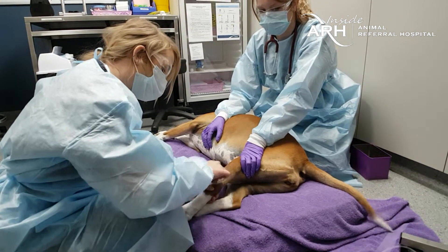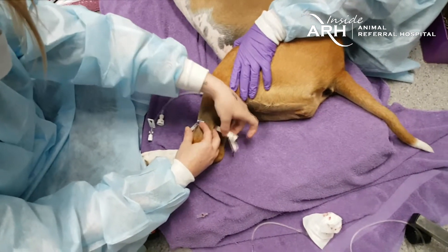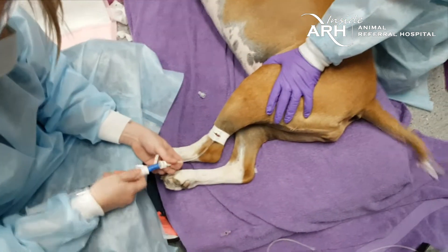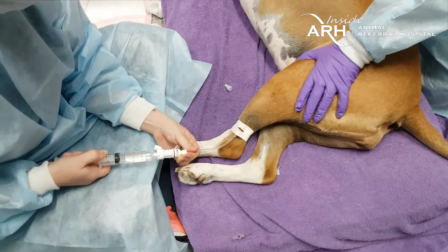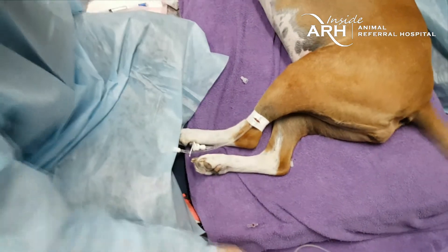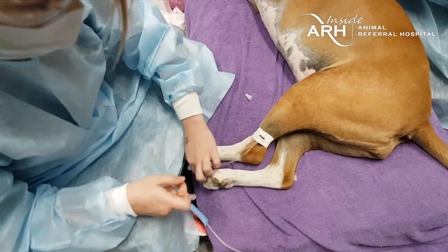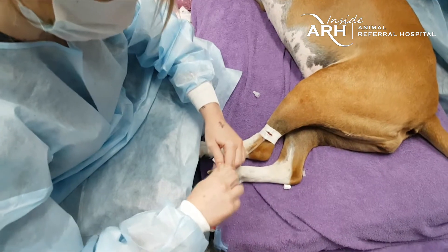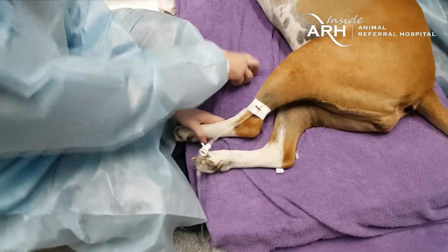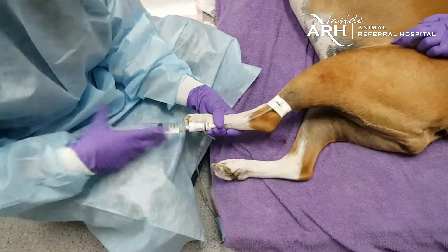A peripheral leg vein is preferred for the administration of chemotherapy — as shown here, the lateral saphenous vein. A clean venipuncture technique is required to minimize any risk of extravasation, which means any extrusion of the chemical outside of the vein, which can cause a local tissue reaction. Once it is verified that the fluid line is flowing appropriately and accurate catheter placement is confirmed, the infusion of the chemotherapy will begin.